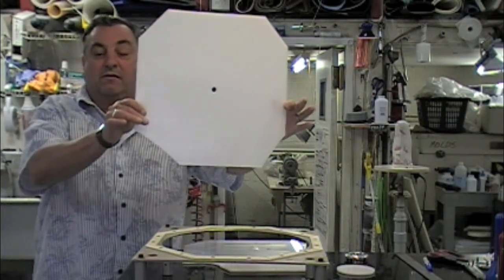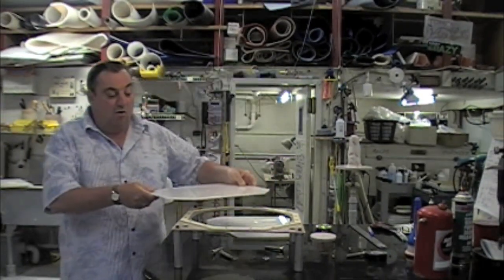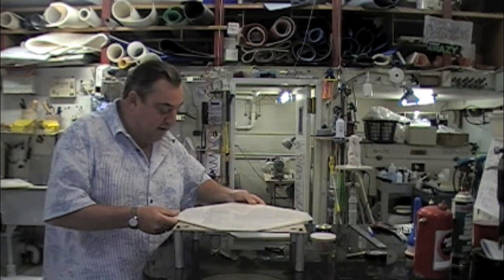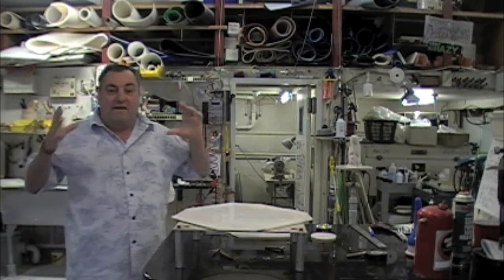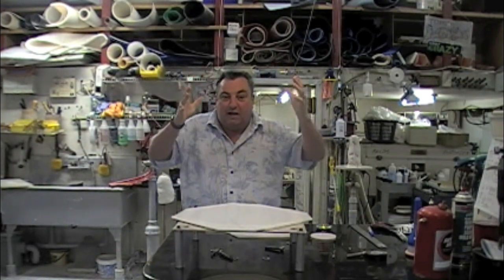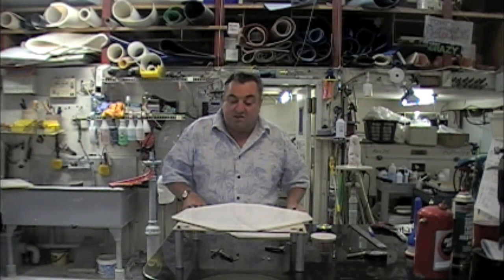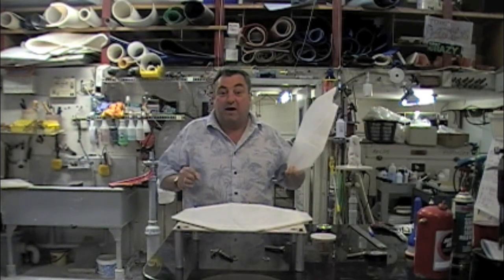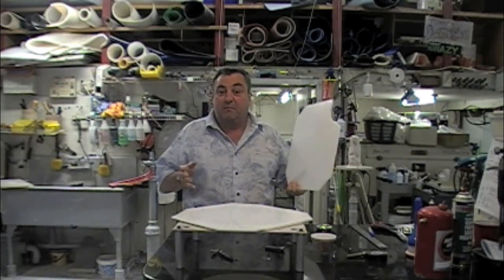First piece: quarter-inch co-polymer with a three-eighths inch hole drilled in the center of it. The hole is there for a vent, believe it or not. Because these two pieces are going to be sandwiched together in the oven, and when they're sandwiched they're going to expand with temperature and then slowly collapse one down on top of another, creating one piece of material out of two. Since we're going to be welding them in the oven, these two pieces have to be very clean — washed with a biodegradable cleaner, rinsed well, and dried before assembly.